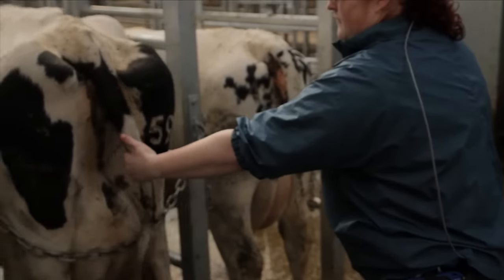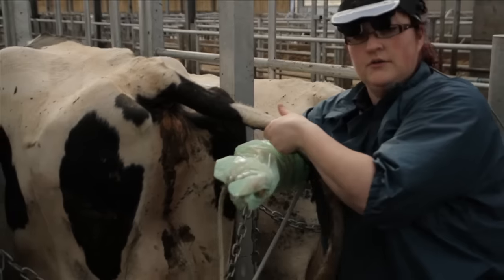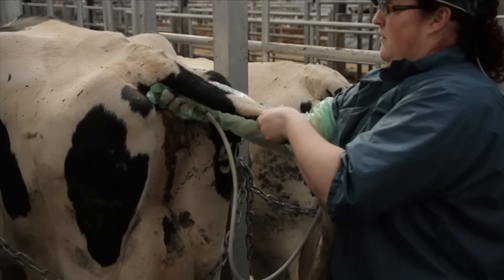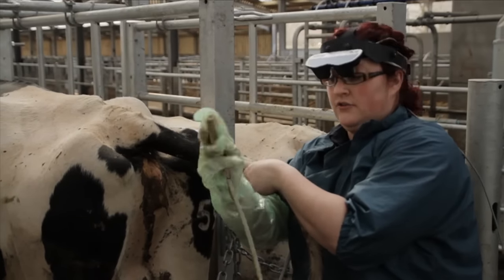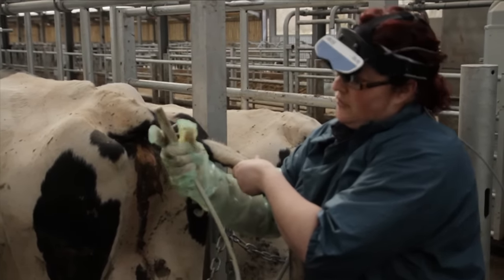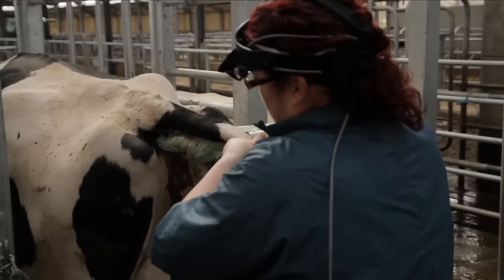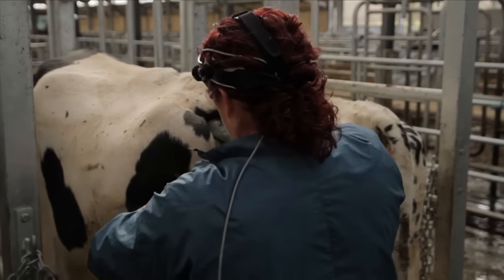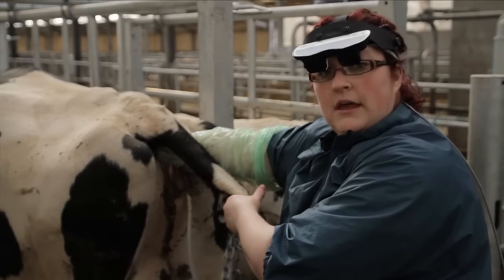Come to our next cow, use the back of our hand, grasp the probe with a leading edge, hold it in the palm of our hand, use our thumb as a backstop, and go into the cow.